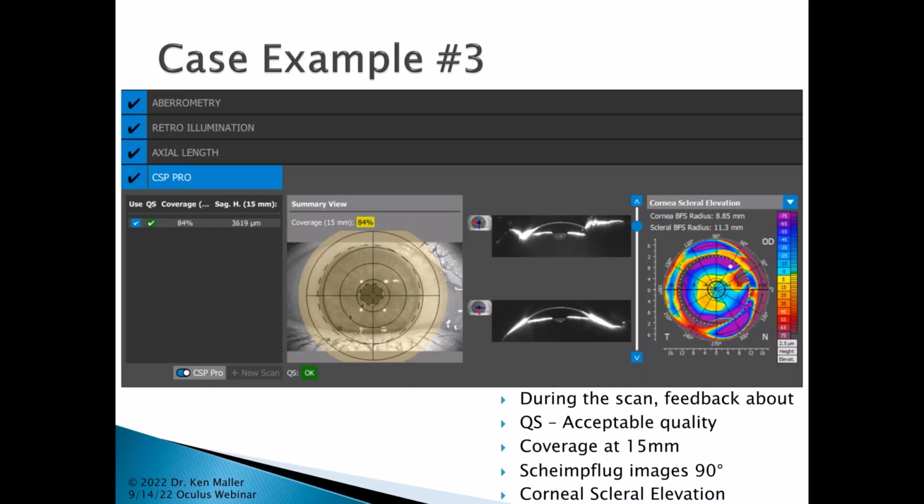Now, I do my own scans, but for those of you who delegate this out to techs, this is a place where, while they're taking this scan, you can take a look at this particular data that is being given during the actual scan and give the techs benchmarks as to what you expect so that you know that you're going to get good scans from them.